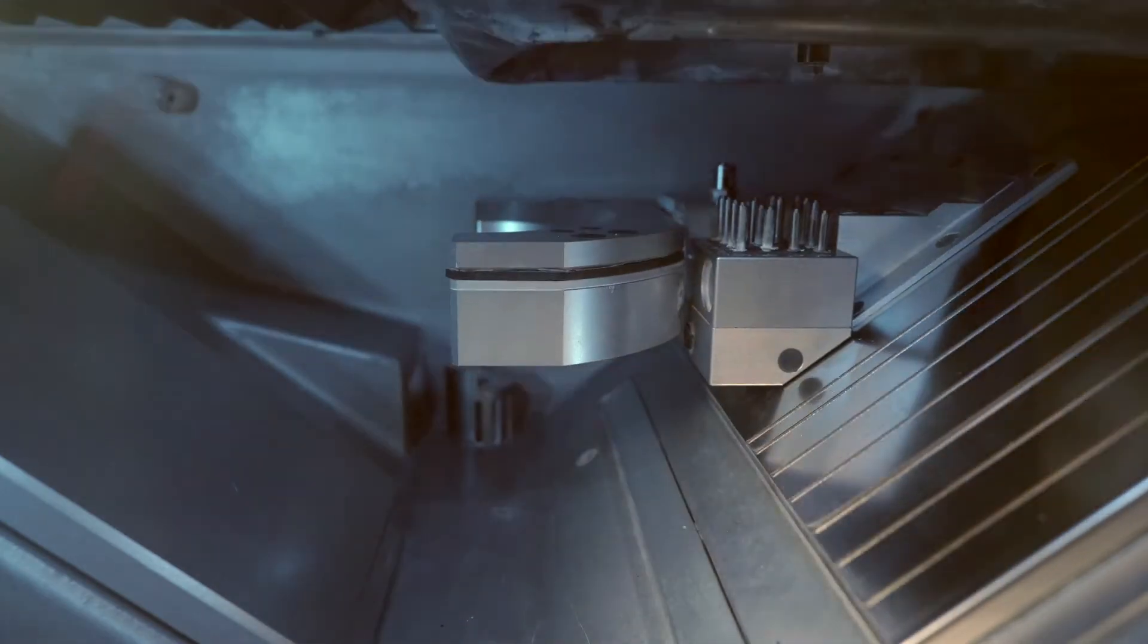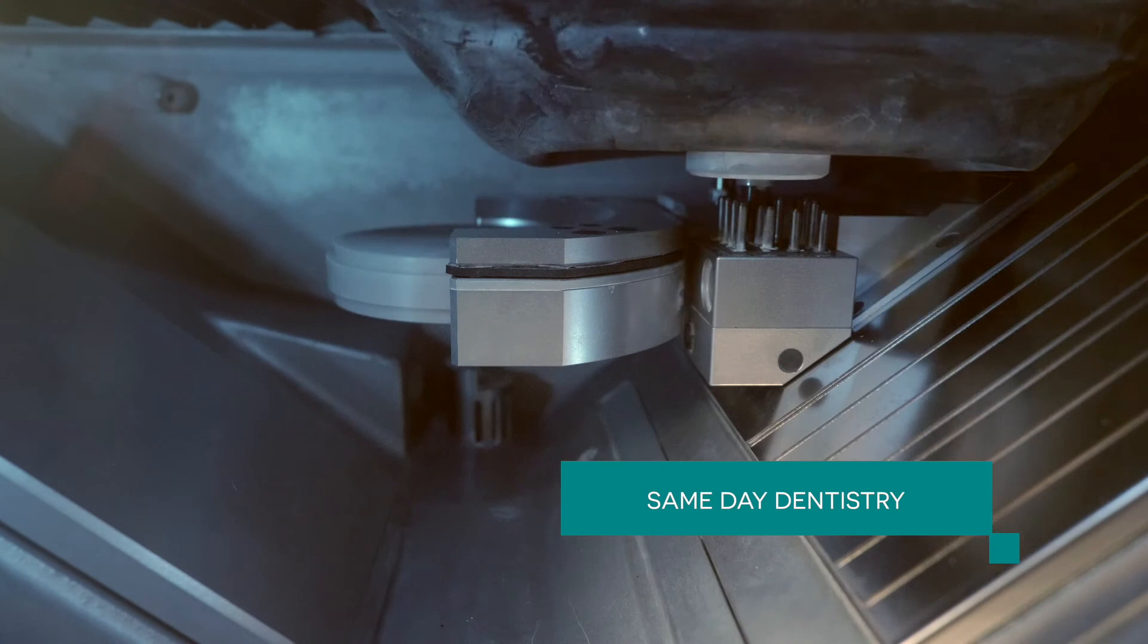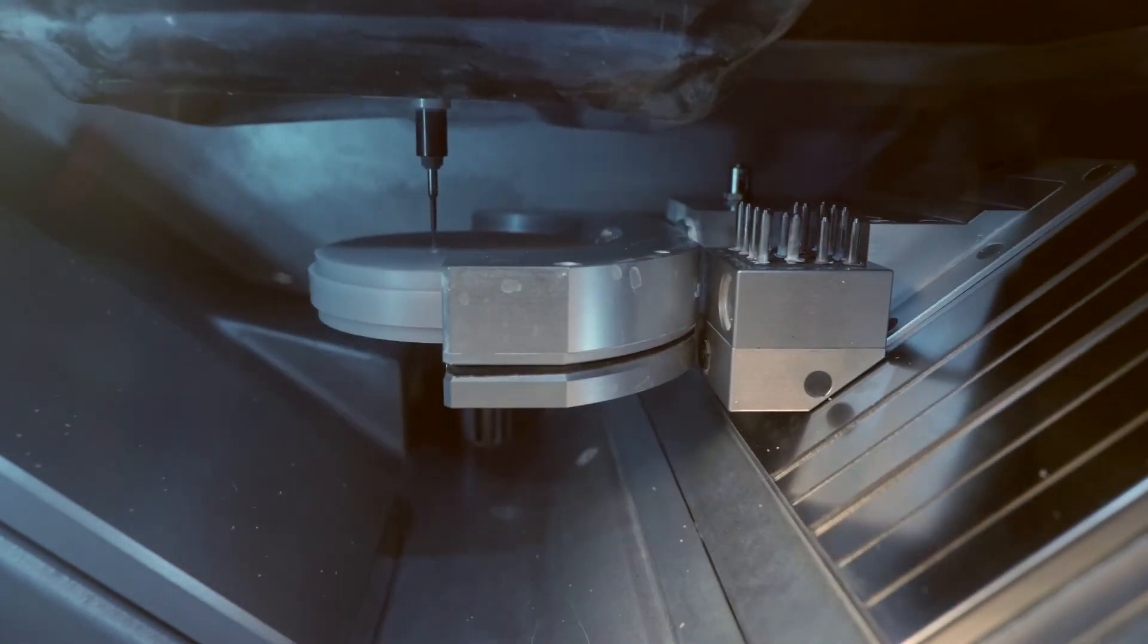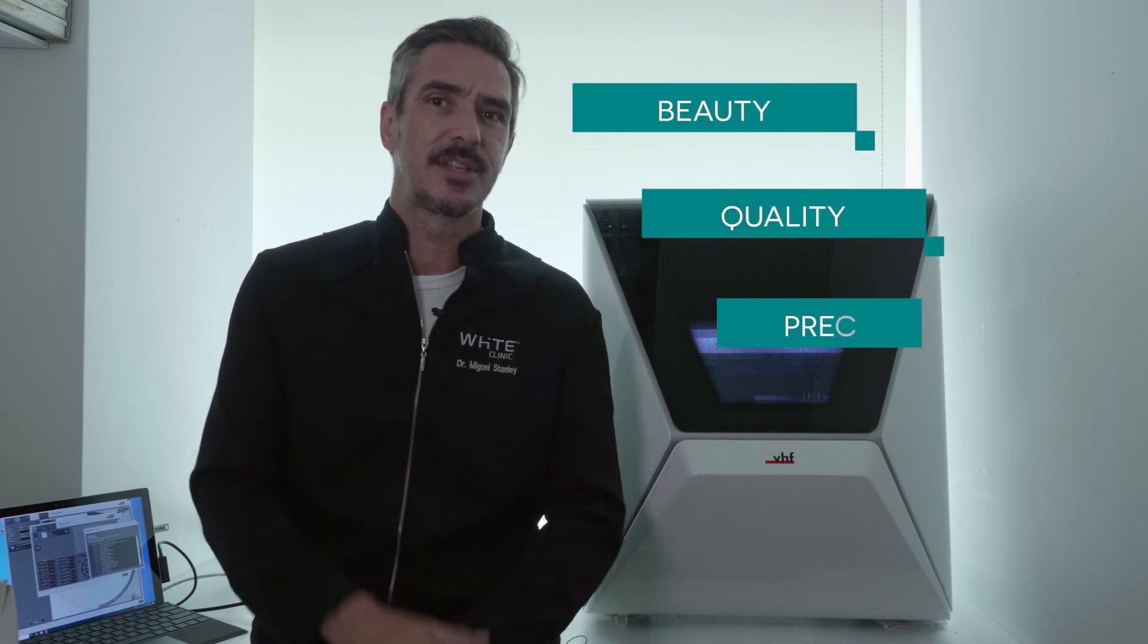This technology in the clinic allows us to do same day dentistry with final restorations in the same day, with incredible beauty, incredible texture and precision.